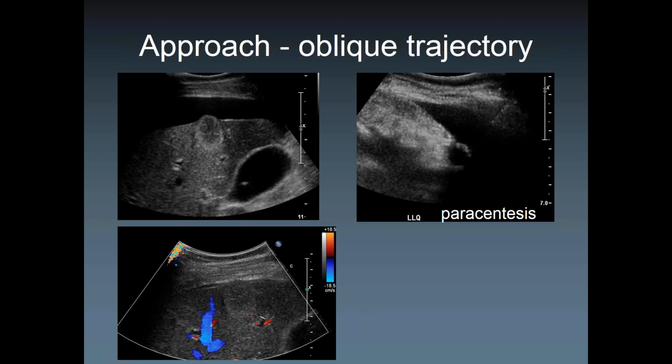Okay, so here that's a lesion with color, obviously. In this case, what we did is we removed the ascites. It's as easy as that, right? So ascites is not something that has to be permanent. You can just take it out in the same session. By doing so, you are safer and have the target here. This is the pigtail catheter, and then you can do the biopsy with a little bit of liver in between at least. You could have done this here too, but again, try to minimize risk for seeding and bleeding if you have ascites on board. That's the needle in the target.